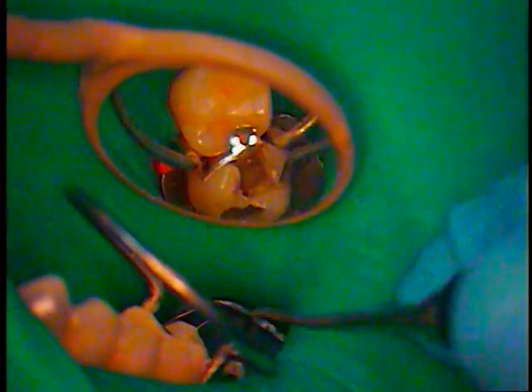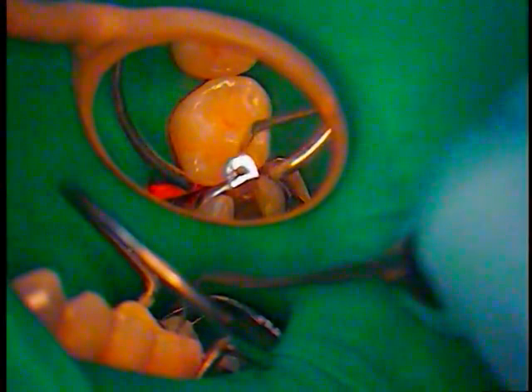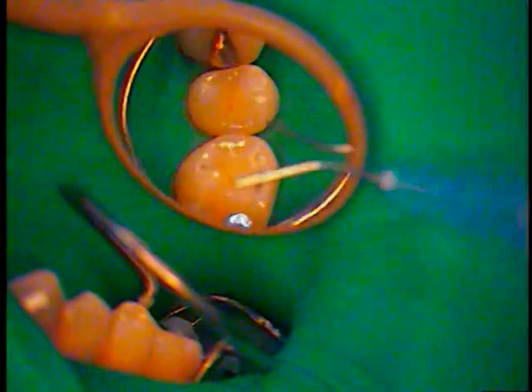Double-checking margins. Okay, so we're going to go ahead and etch next.